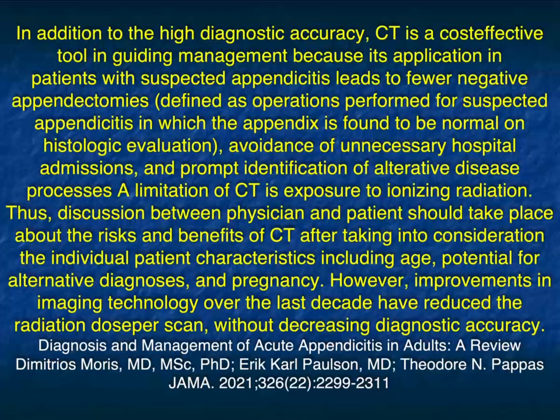It also leads to avoidance of unnecessary hospital admissions, and proper identification of alternative diagnosis. And I mentioned at the beginning things like diverticulitis or colon cancer or infections like typhlitis, TB. Other possibilities can simulate appendicitis, but CT is very good about picking what patients have appendicitis and making alternative diagnosis.